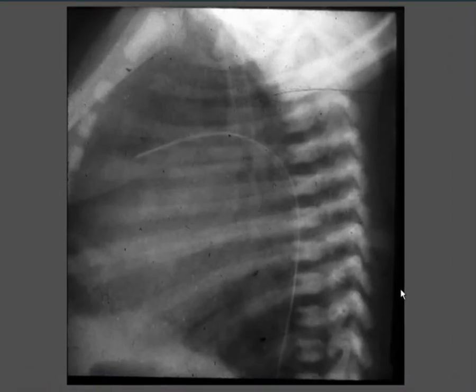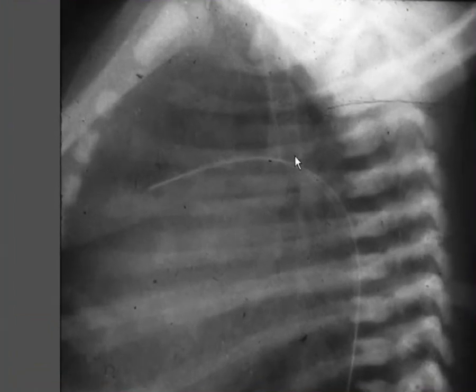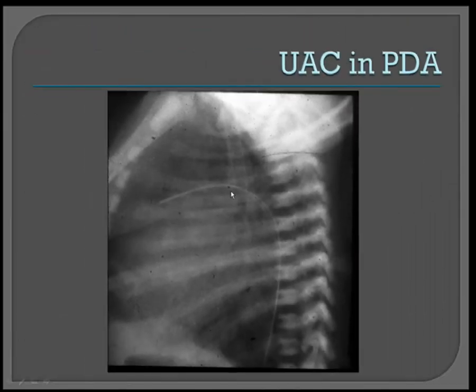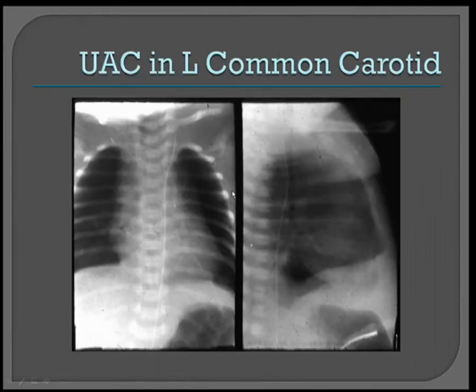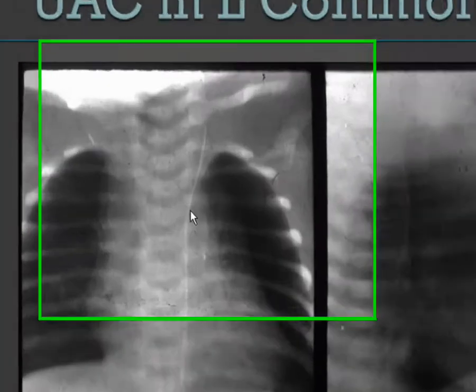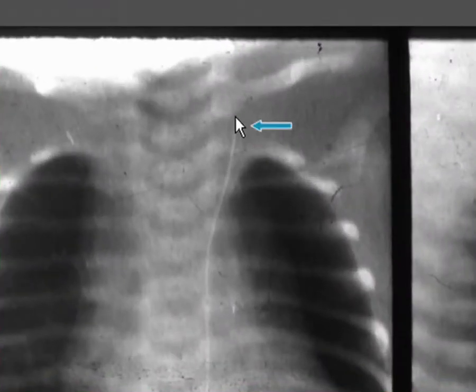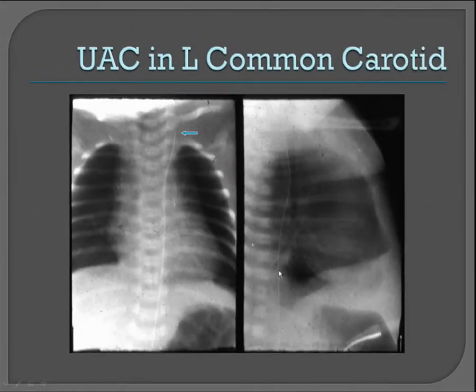Now we'll talk about some malpositions of UACs. You can see that this UAC comes all the way up and takes a turn into the patent ductus arteriosus here. This is another example of a UAC that's come a little bit too high — here we can see it coming up the aorta and ending in the left common carotid artery in the neck. Here's the lateral view.